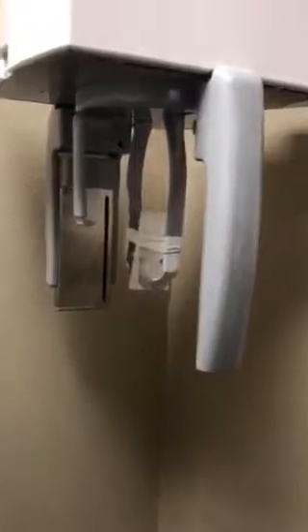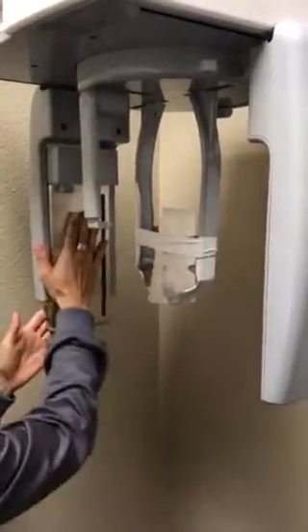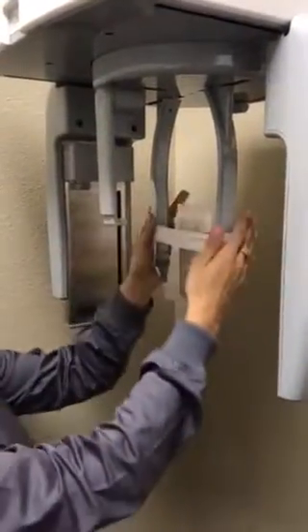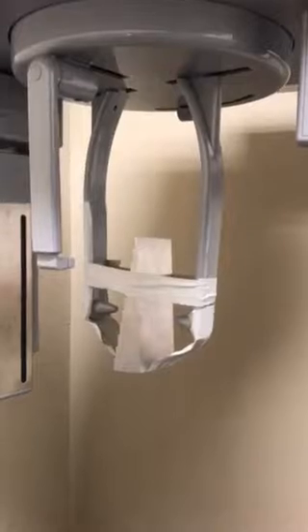So it worked in the room with the sensor that we take our bite wings and our PAs with, but it did not work on here. We taped it onto here. So this is what we did. We jerry-rigged it. We just pretty much taped it on here the way where the patient would normally have their head, and this is how we were able to get a successful taking of it.